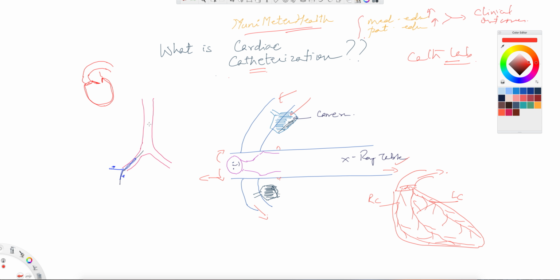But normally, an EKG is already done prior, within a week, so that's good enough. Otherwise, they'll quickly get an EKG and bring you into the cath lab. A small needle is inserted after a small local anesthesia right in this area, for instance, and through the needle there's a guide wire. This black little wire is inserted and passed through, and the needle is withdrawn.